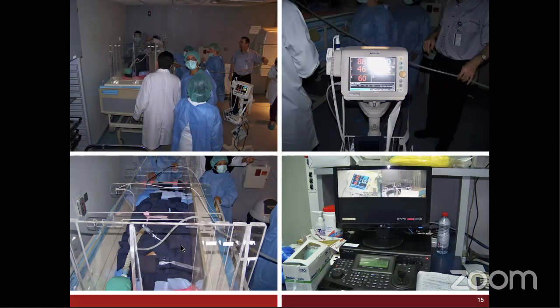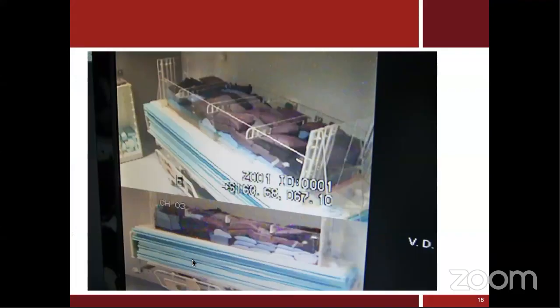So we're converting this patient essentially to just like a box. So that's how we do our TBI. This is another view of the patient inside the TBI box, where we're putting rice bags to fill this box.